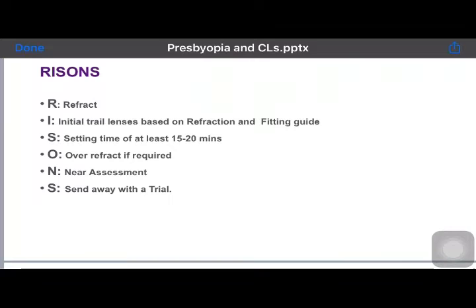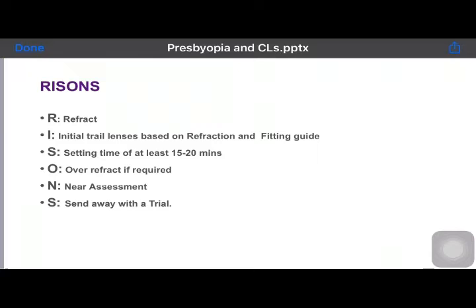the concept remains the same, but when you are fitting multifocal lenses, and if both the eyes are okay and there is no amblyopia in the patient's eyes, the patient will accept blur, but one eye will be much more blurred and the other eye will be less blurred, or the patient can appreciate the image shifting and not shifting. In amblyopia, if there is a major amblyopia, they might not be able to appreciate the blur, or they might not be able to appreciate the shifting of the image. So that is the only thing that will differ in this case. Otherwise, they are the same.